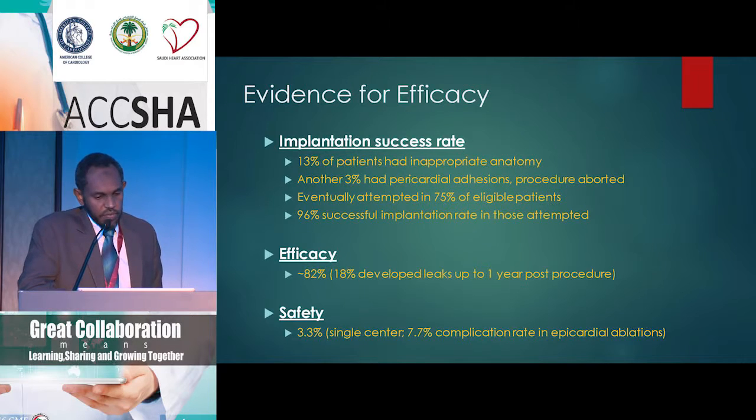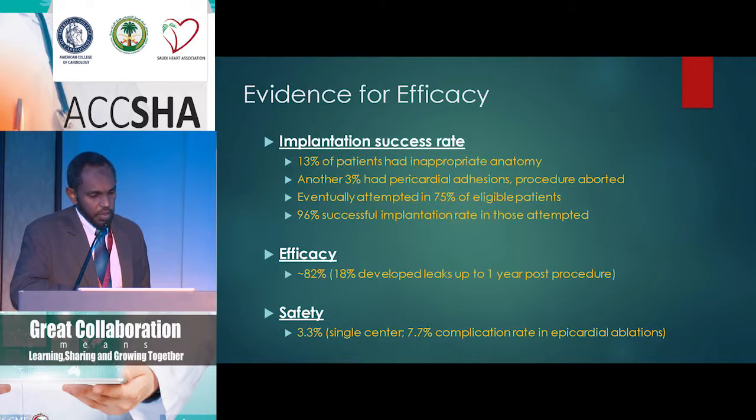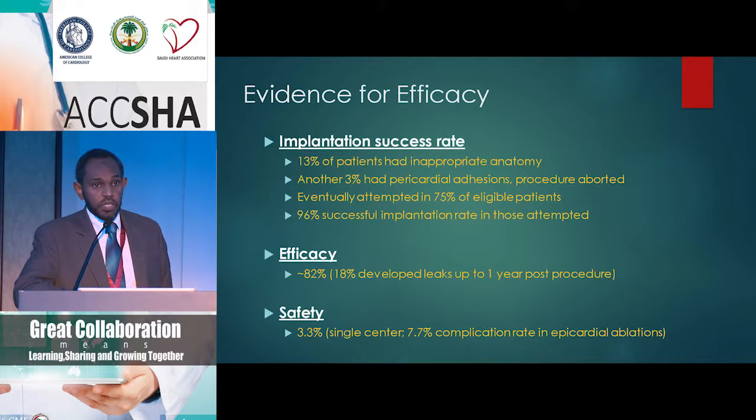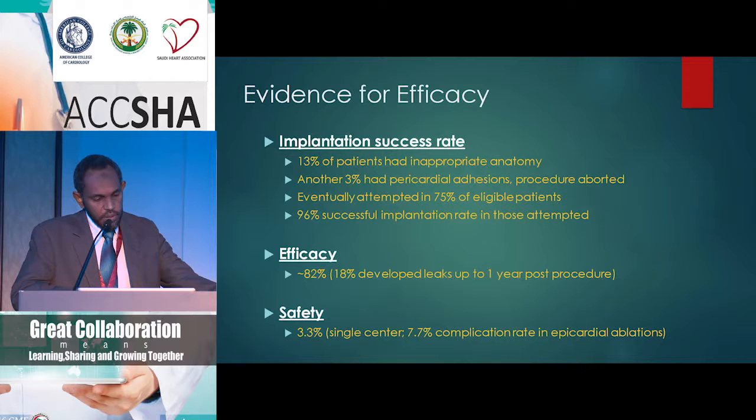Efficacy is a difficult number to come up with, but from that trial, around 18% of patients had leaks up to 1 year post-procedure. So even after they closed it, some patients did develop leaks later on during the course. And finally, regarding safety, the number I record here is from this one trial.